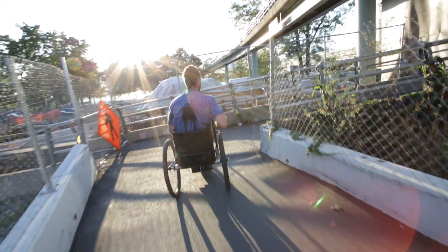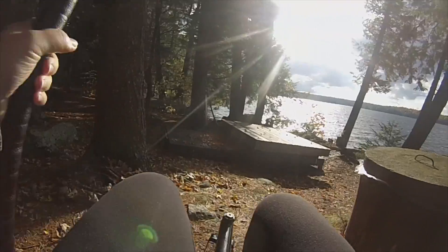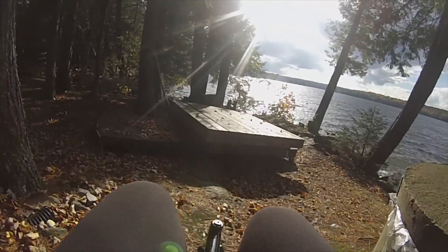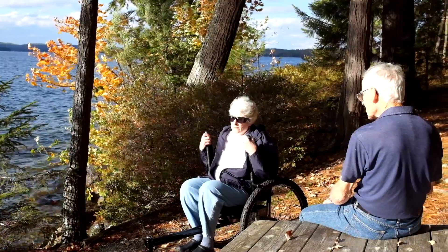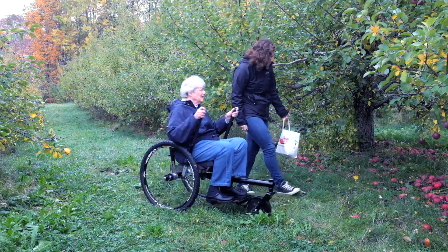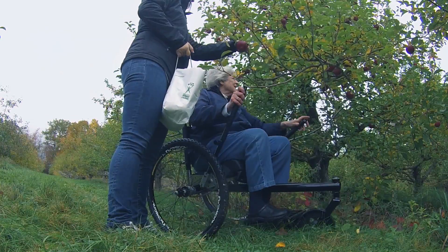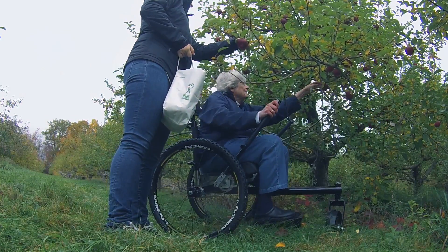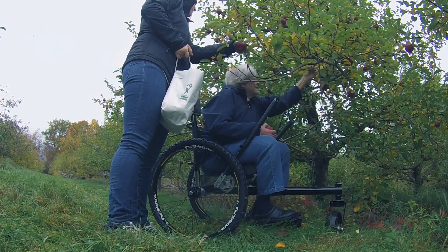People in wheelchairs want to get off the road. They want to be away from the sidewalk. It's not very fun going outside and you creep up and then all you see is that edge, but you can't go past it because your chair is going to get stuck. Being able to say there are other options out there, you can go past that edge — that's the whole point of rehab, to push someone closer to the edge and find a new edge to push them to. It's faster and more mobile, definitely getting on and off the road.